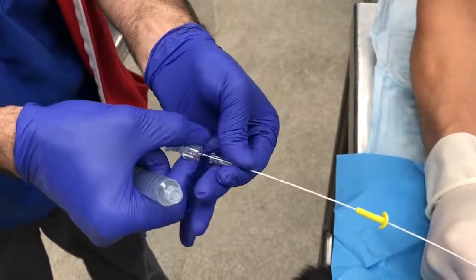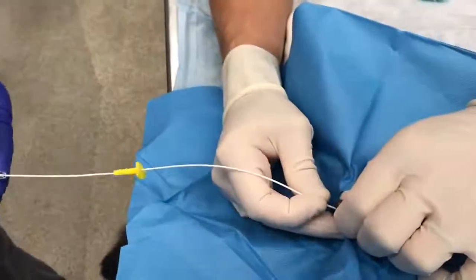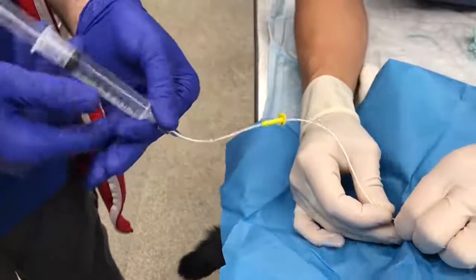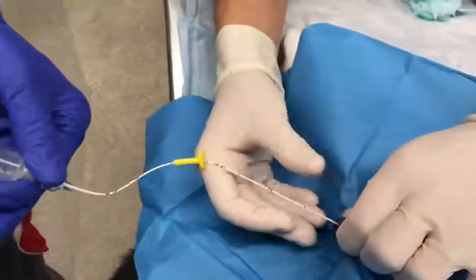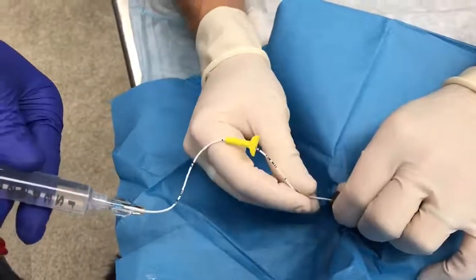Once the catheter flushes easily, remove the stylet to decrease the incidence of urethral trauma. If the catheter doesn't advance easily, you may reattach a flush and while flushing, advance the catheter into the bladder to the pre-placed suture device.